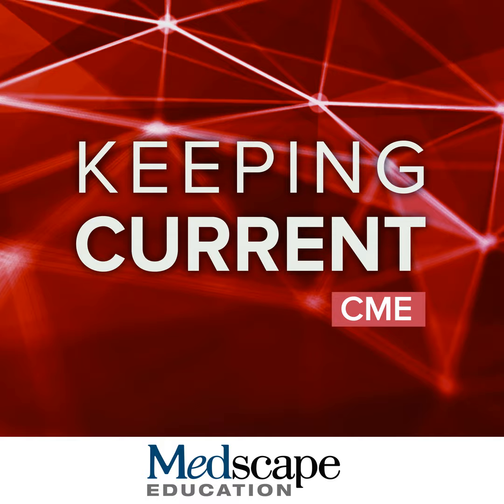What about intrahepatic recurrence post-resection? Very similar findings. We can see that the patients with HCCs which do have perilesional hepatobiliary phase hypoenhancement have higher and faster chances of intrahepatic recurrence as compared to those without this feature. And again, this difference is statistically significant.